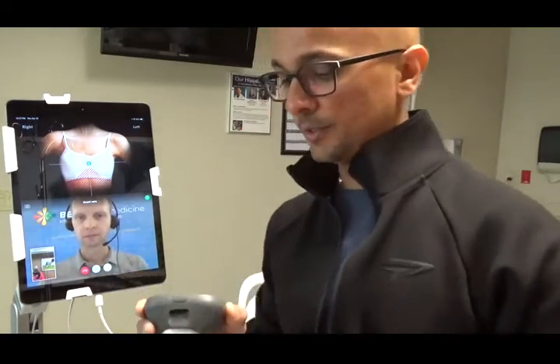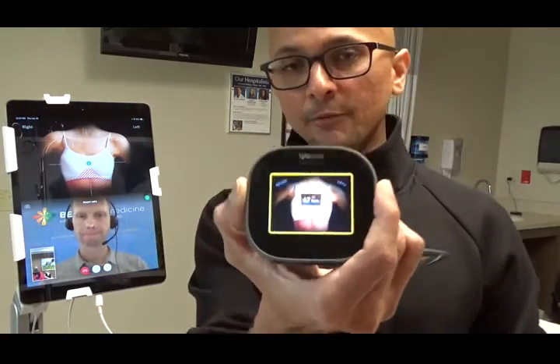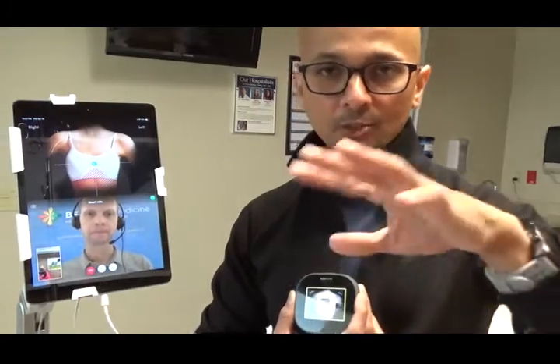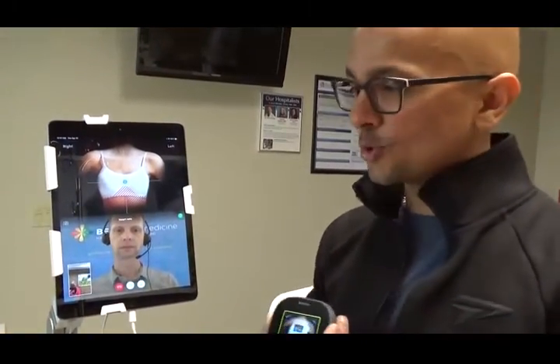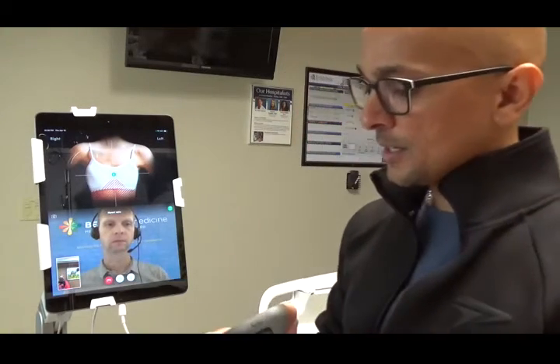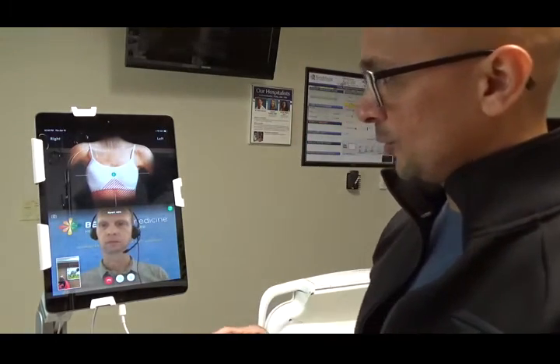Okay, good. So we got 67, and for the pulse, it's about 20 seconds that you kind of have to put there, and it recognizes your average pulse. Okay, so you just have to wait a little bit. Usually it's not needed in the hospital setting because you already have bedside pulse, along with pulse ox, etc. All right, next, what would you like to move to?